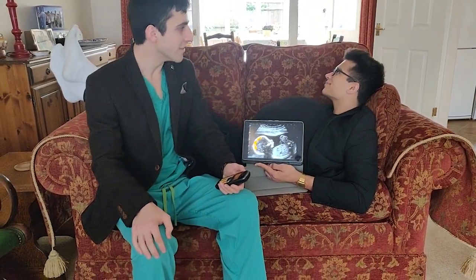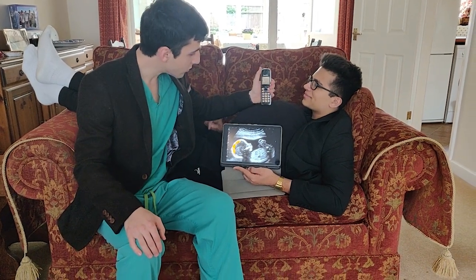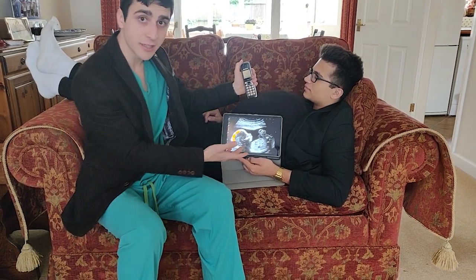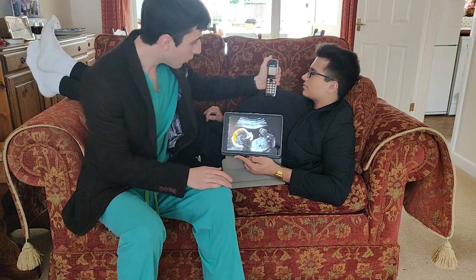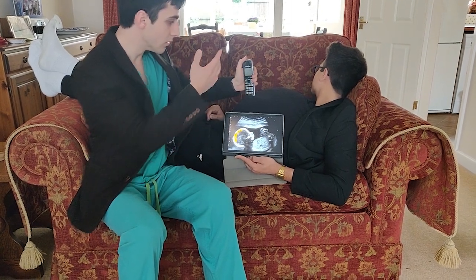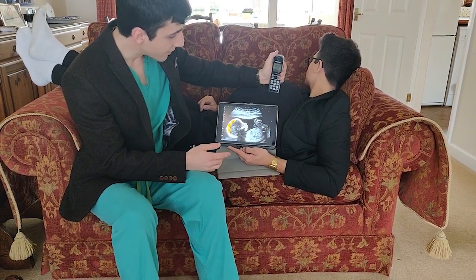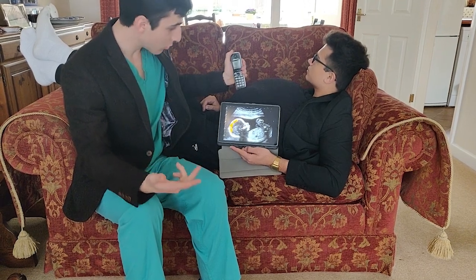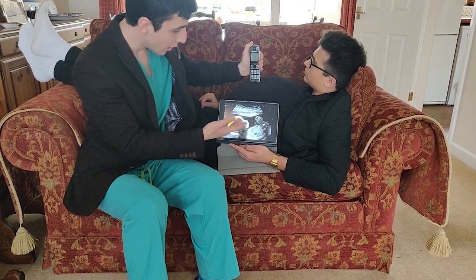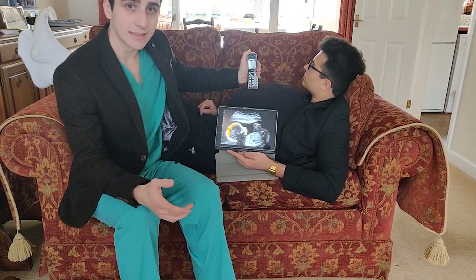Hello, Ben. Now that baby's getting bigger, it's about time you had a B scan, or a brightness scan. This ultrasound method uses many transducers to combine multiple A scans to give a 3D or 2D real-time image of what's inside. The amplitude of the reflected signals from the transducers dictates the brightness on the display. And as different tissues such as bone, liquids and muscle tissue reflect different proportions of the ultrasound, this affects the brightness on the display. This is commonly used to check for abnormalities in babies.